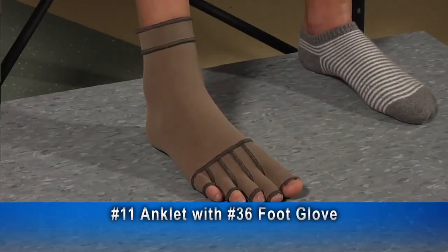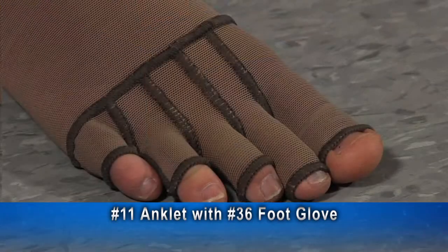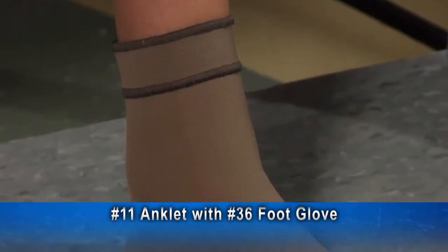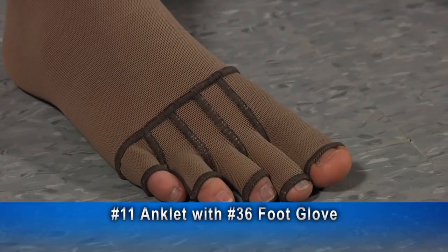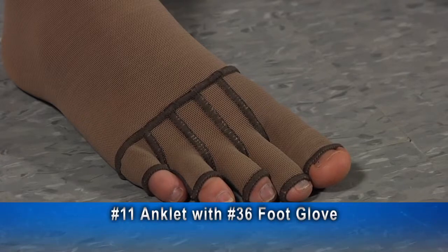This number 11 anklet has a number 36 foot glove attached to it. This example has separate enclosures for each toe, and all the toes are open-tipped. Just like for hand gloves, any combination of toes may be open or closed-tipped, and 2 or more toes may share a common opening.